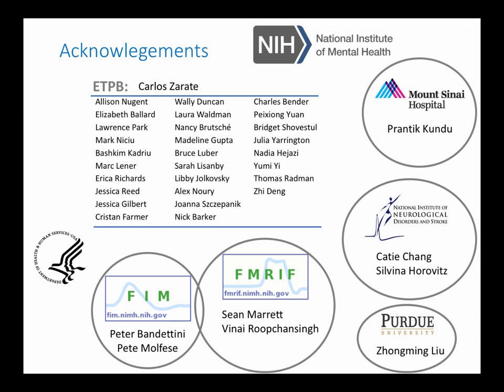Is there equipment that could simultaneously measure PET and fMRI? Yeah, NIH has a PET-fMRI scanner. The main trick there is that the coil, since it's between the person's head and the detectors, has to be modeled properly, because PET measures the radioactivity, the emissions, coming off, and you're going to get a reduced amount from the coil, so that has to be modeled. But yes, that can be done, and can be done here too at NIH. So that's something that I'm interested in doing as well, as long as you have the binding agent to bind to what you're looking for.